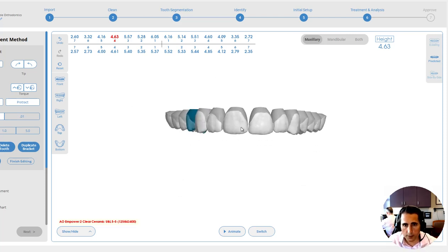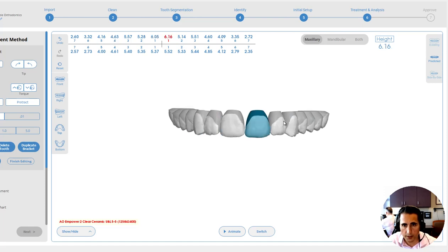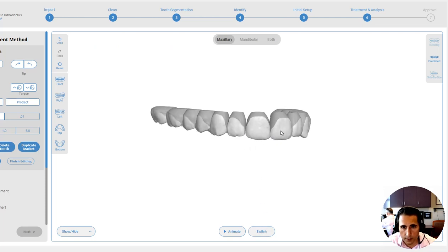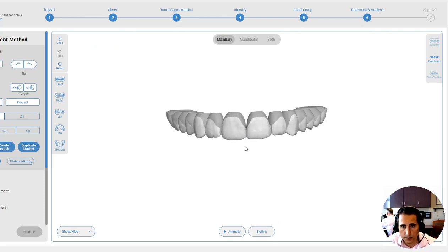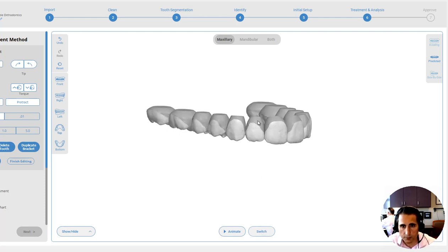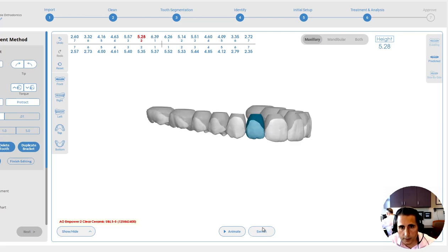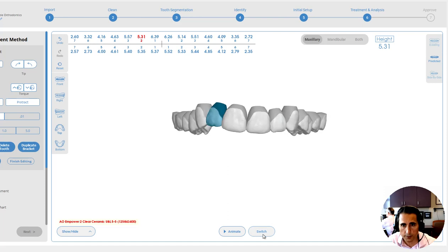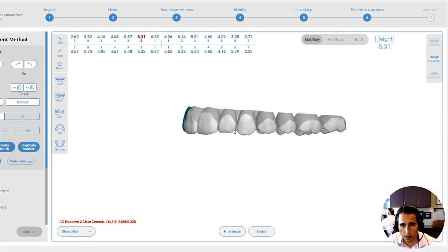What we want to see is that anterior cant correction. When we scroll back and forth between the before and the finish, we want to see that happening. We have a little bit of overcorrection there, so I'm going to add a tiny bit of overcorrection on the other central and bring that down just a bit. That's looking good — that may be slightly more than we need. If you hold that control button, you can move the teeth together so any of those artificial interferences between contacts can get rid of — to get a better visualization of what you're setting up. If anything, that's slightly overcorrected, so I'm just going to take a little bit of that overcorrection out. As those teeth level out, they're going to level out according to where the bone is.